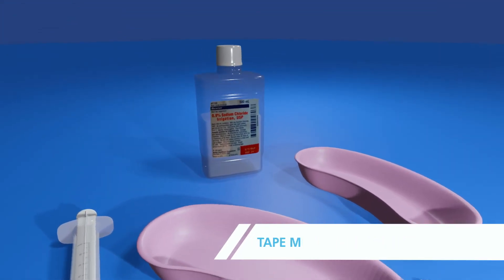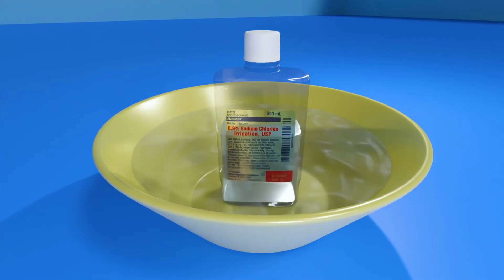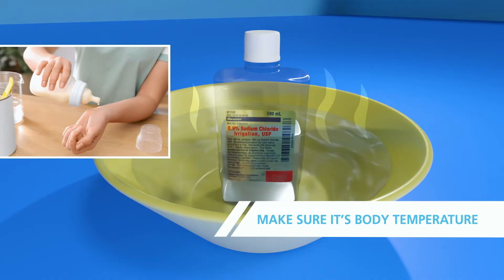To begin, warm the normal saline. We recommend placing the bottle of saline in a sink or bowl of warm water. After a few minutes, test the temperature of the saline on the inside of your wrist to make sure it's body temperature. This is like warming a baby bottle.